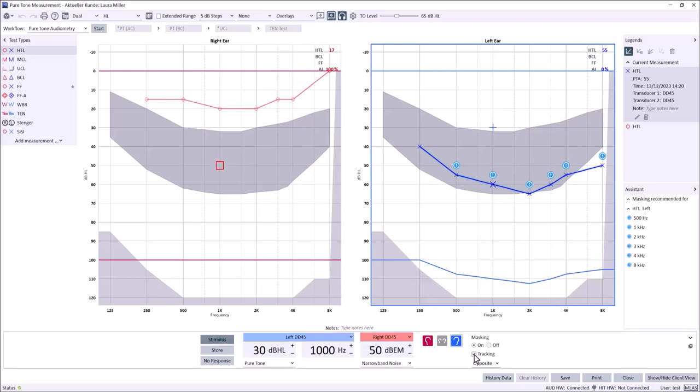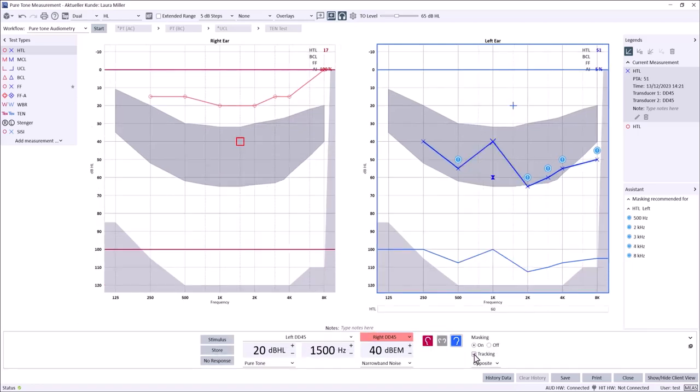To the right of this selection, transducer and stimuli type can be adjusted. Typically, masking is indicated for bone conduction when an air bone gap of greater than 10 dB is noted.